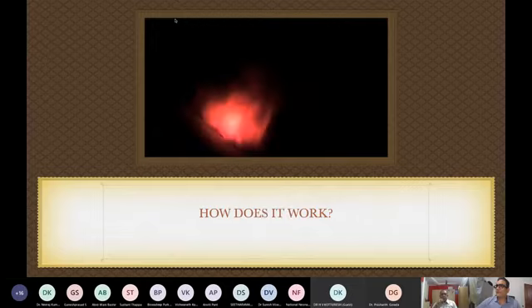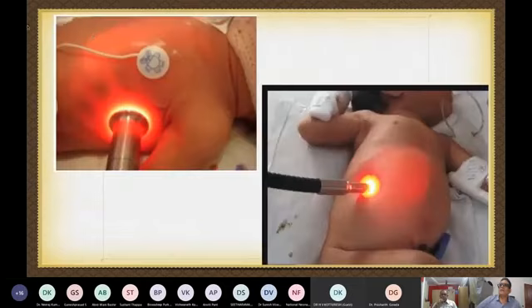Okay, and also in this baby, the pneumothorax, the chest: when you transilluminate the chest, you will normally see only a small halo around the light, which is normal. But in this baby, you can see that the whole chest is transilluminated, showing that there is a left pneumothorax. And in the second baby on the right here, you can see that the abdomen is brilliantly getting transilluminated, suggesting that there may be a perforation in this area. So these are some benefits of transillumination.